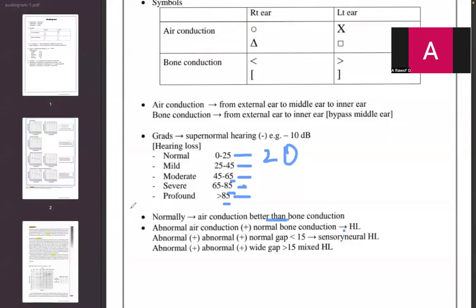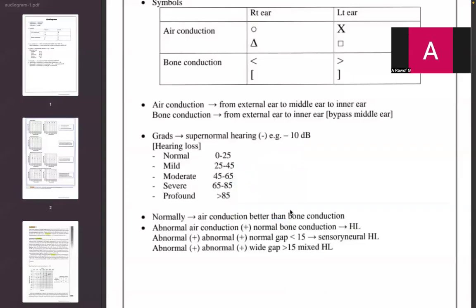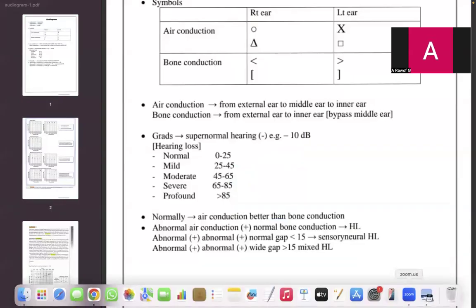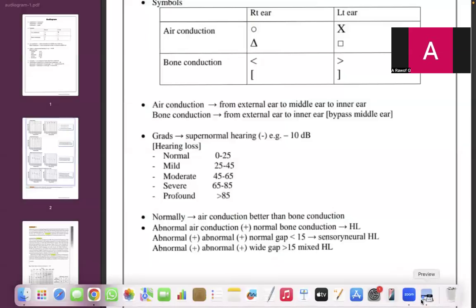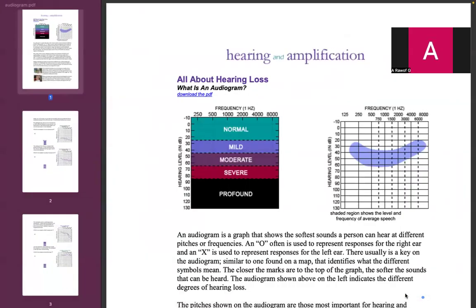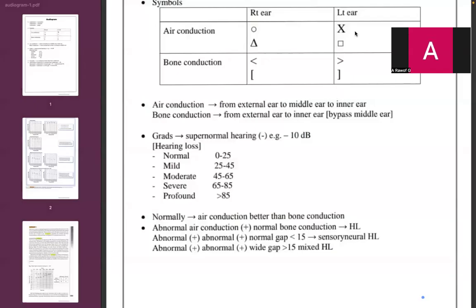Normally, air conduction is better than bone conduction.